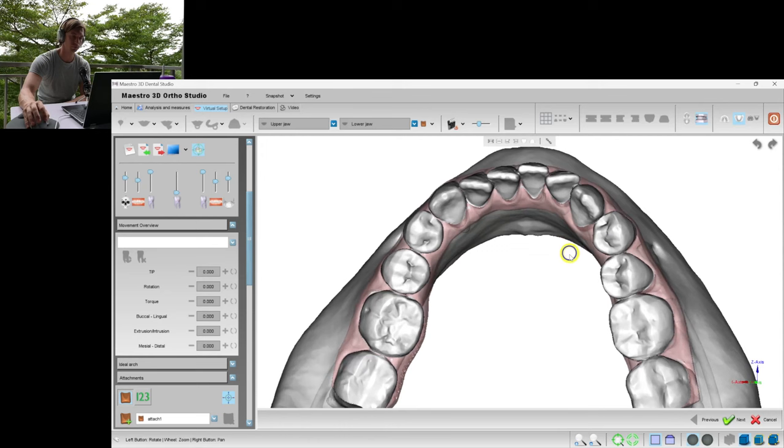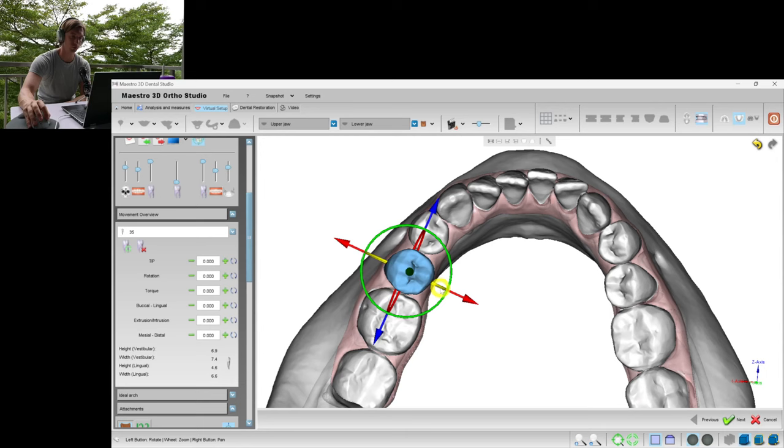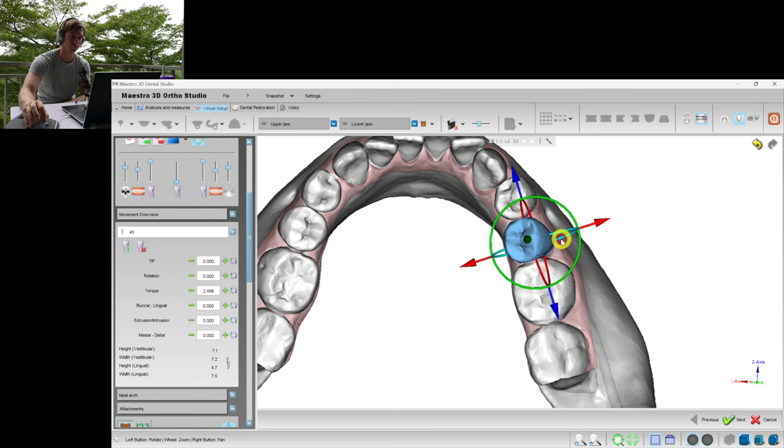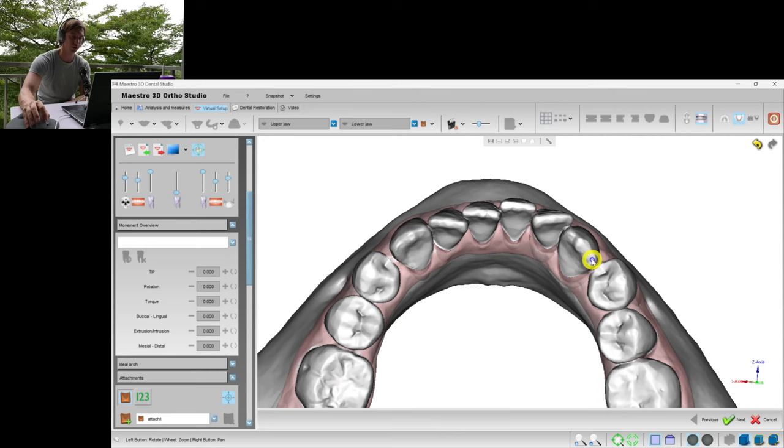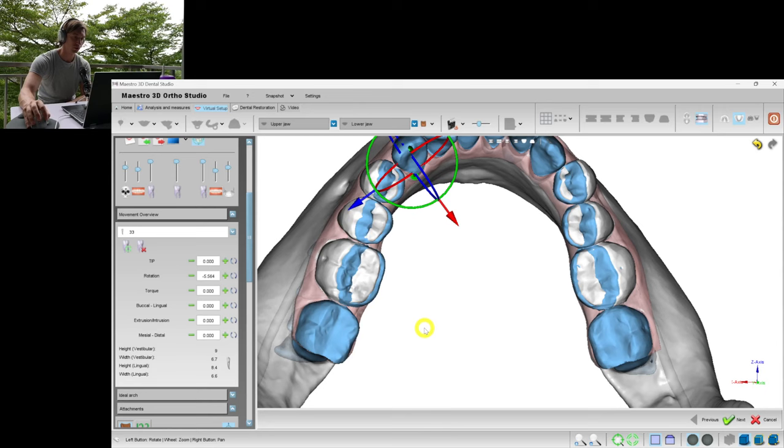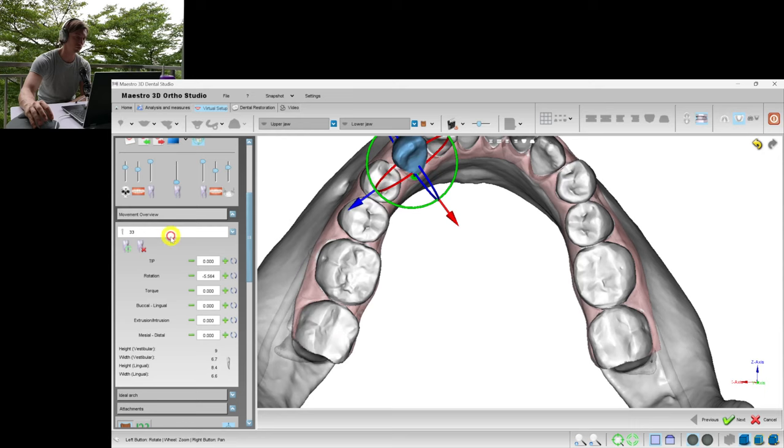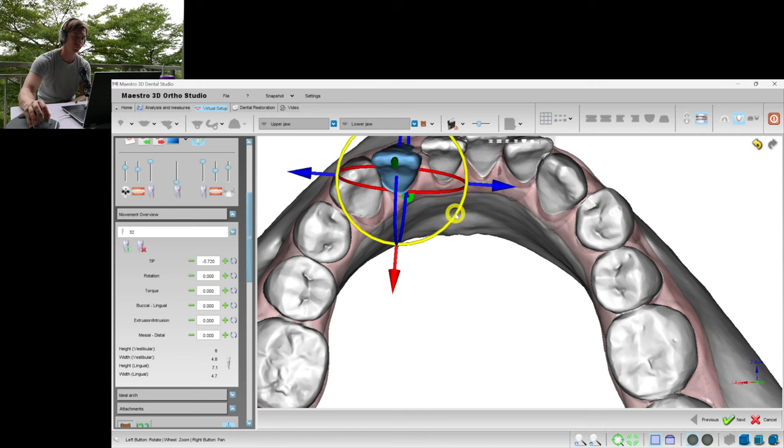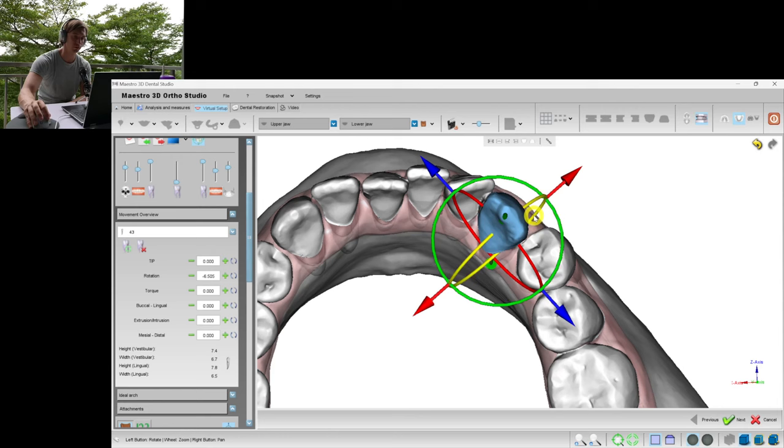In such cases with crowding, I always start with the expansion. We're limited in space and we need to create some. So the first way of obtaining some space in the arch is expansion. I don't expand the second molars because aligners are just limited in moving the teeth towards the buccal direction. The only predictable movement for the second molars is distalization, I mean with aligners of course, with just aligners without any auxiliary things.